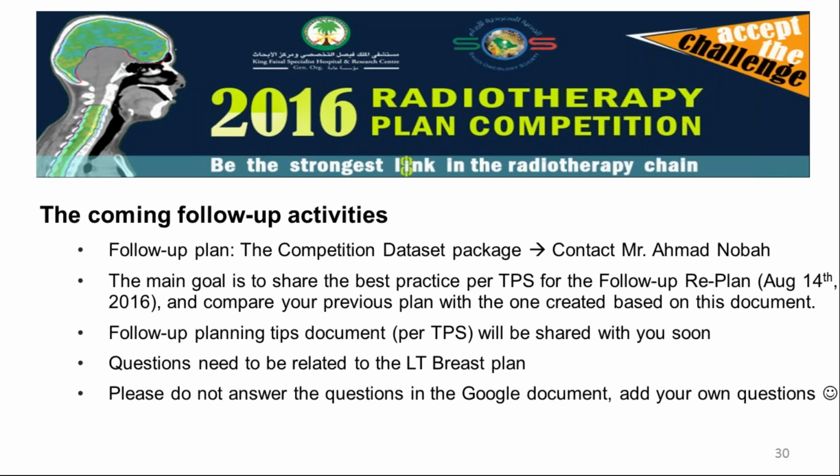The main goal of this follow-up is that you can find out yourself how much you have improved after this plan competition. Suppose that you scored, let's say, 60 out of 100, and then you take the document that we will prepare and share with you, and use the guidelines of the top planners. We will ask you to replan and see what your score will be. This is how we can have a quantitative measure of how much you improved your planning quality.